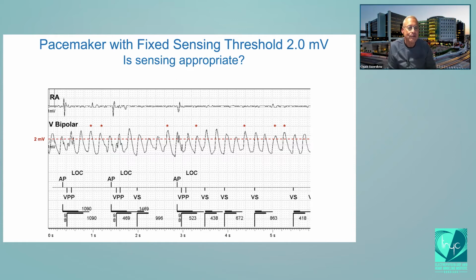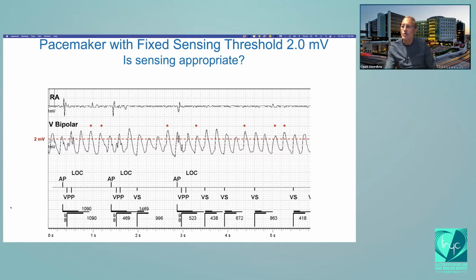And I'll tell you, this is an episode of ventricular fibrillation. It looks appropriate. So, okay, let's look at what we have here. We have the mark, thank you. By the way, who said that? What's your name?